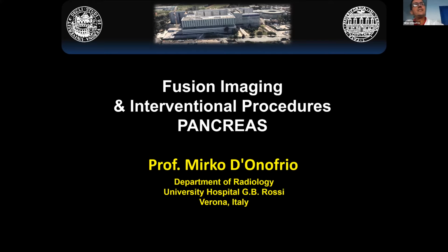Unfortunately, CT is not always good to obtain the correct direction to arrive at lesions in the liver and in the pancreas, you know. So we are using ultrasound more and more, and now it is quite the only imaging technique that we use to guide interventional procedures percutaneously to the pancreas.